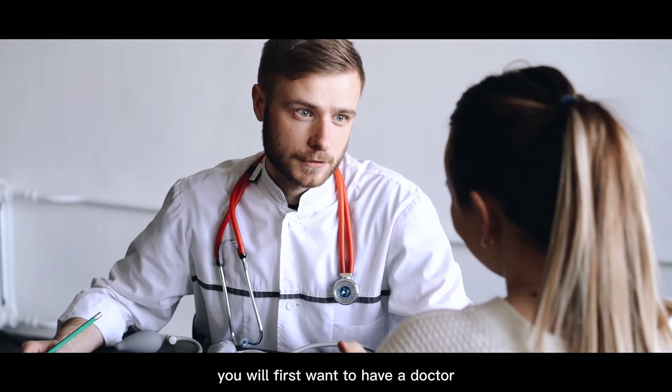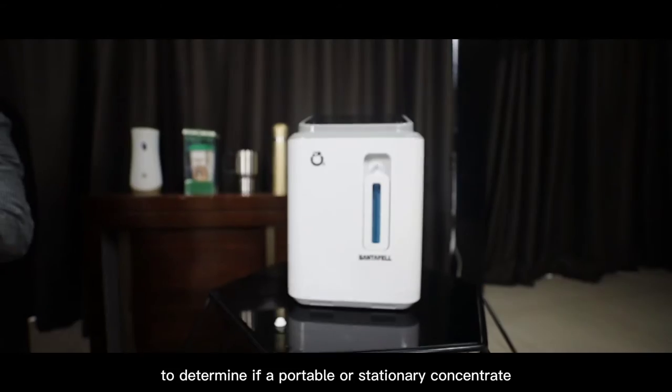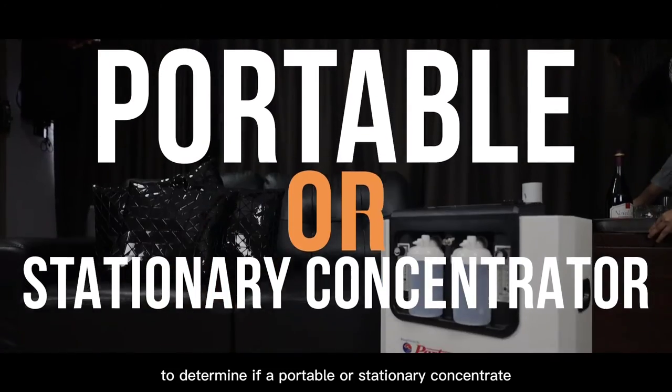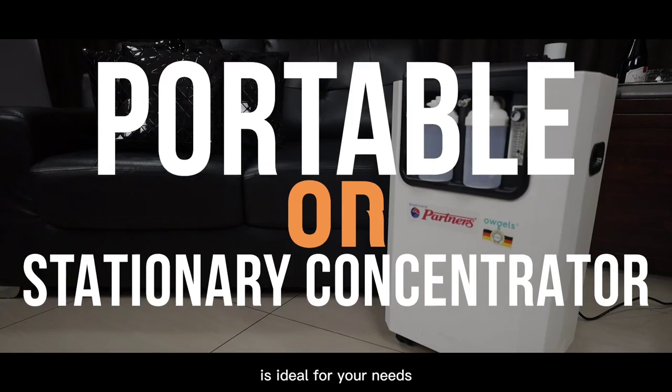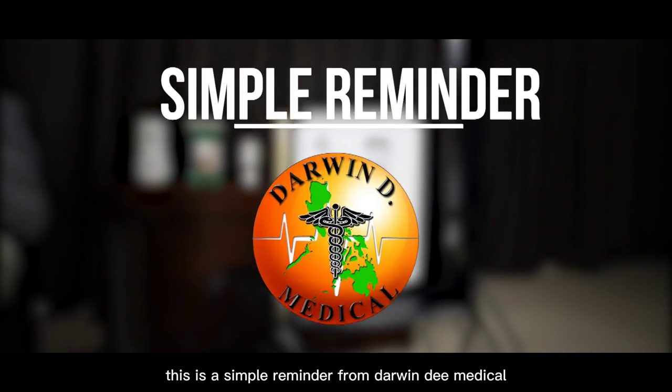You will first want to have a doctor give you a full evaluation to determine if a portable or stationary concentrator is ideal for your needs. This is a simple reminder from Darwin D. Medical.